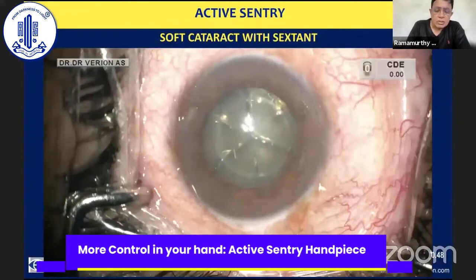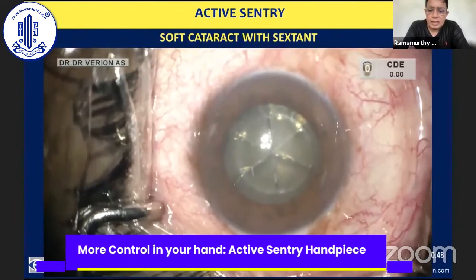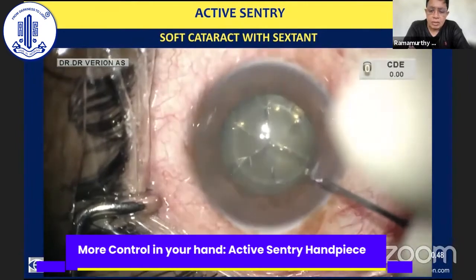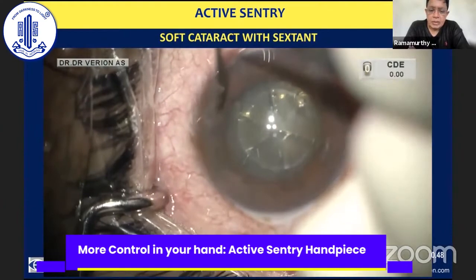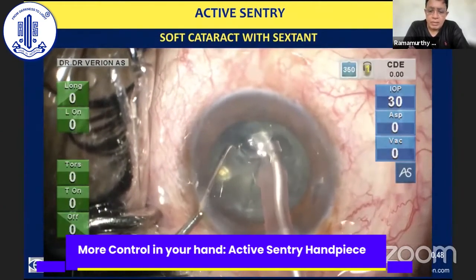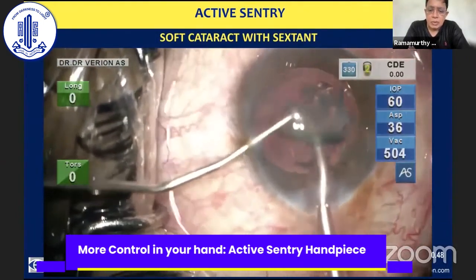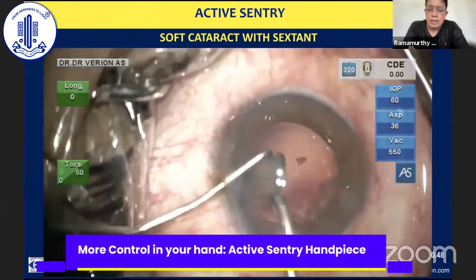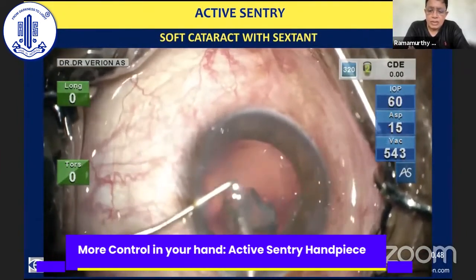And this is just to re-emphasize the first video that I showed. Here again, it's a fairly soft cataract. It's a sextant that has been made with the laser. And always, whenever there is a laser arcuate keratotomy, the first step I do is to open it up before I make the incision. I do not use the laser to make incisions, because I find that what I create with my blades are much better. Here again, the CDE will be absolutely zero right through the surgery. Obviously, we all know that you don't really require the laser even for these cases. As long as you are using the right parameters, the whole procedure goes well.